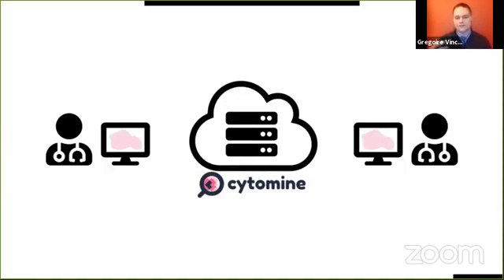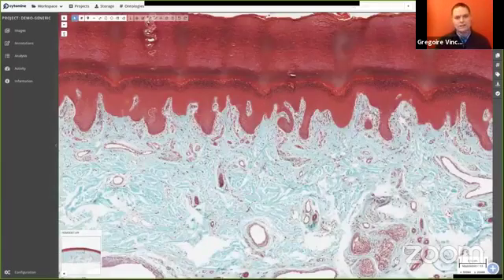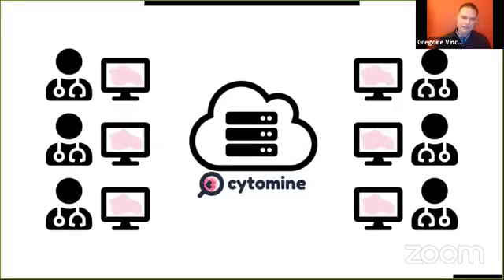And on servers, it's very easy to get scale and to have sufficient power and storage to play the game. So we provide a web interface like this one, where you can open this image and zoom inside and work like if you were in a microscope and add some information like annotation and so on. And like this, people can work on these images like you are sharing, for example, a big image with Google. They can work at the same time, anywhere and anytime, and in one-to-one, but also in team.